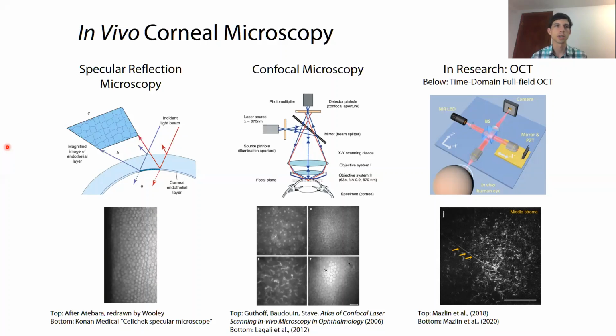In this mode of imaging, a high degree of optical sectioning is required in order to avoid out-of-focus blur, or in the case of non-contact imaging, very strong reflection occurring at the air-cornea refractive index mismatch.